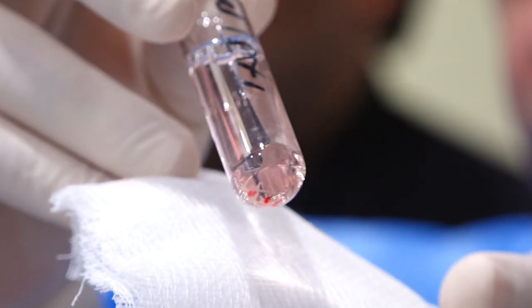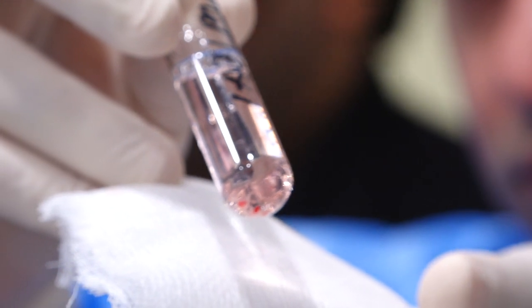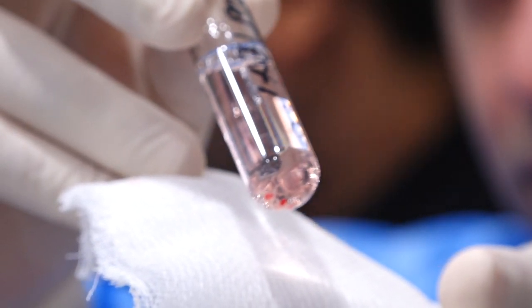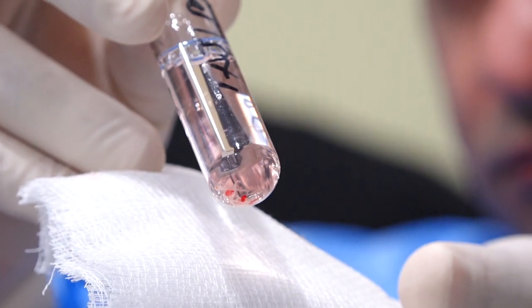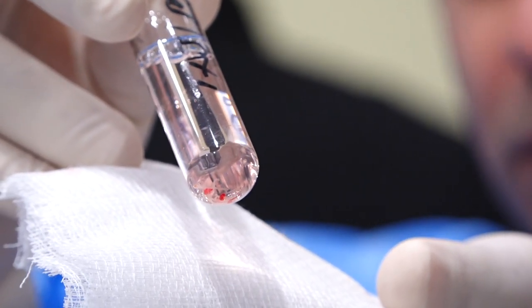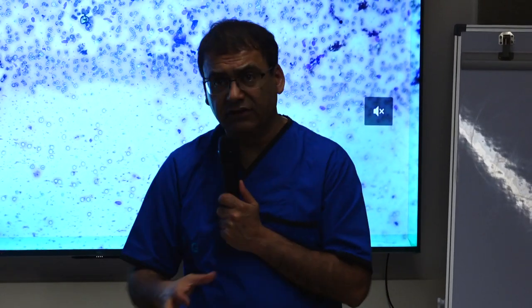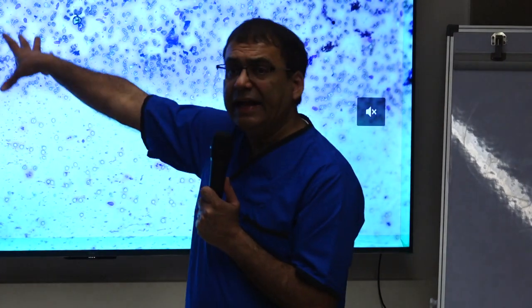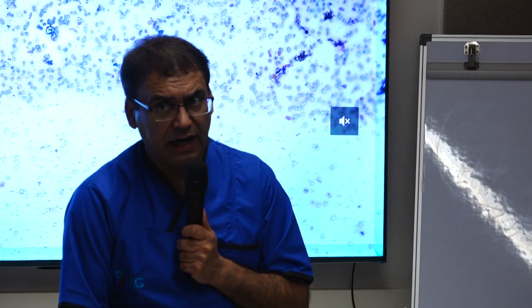It doesn't look like a clot, it looks like actual tissue. Sometimes necrosis can look like tissue in there too, but what helps us here is I don't see any necrosis on the touch prep. So that looks like the real tissue. Tissue is going to look white, not just the clots in there. So that's kind of a macroscopic tissue.